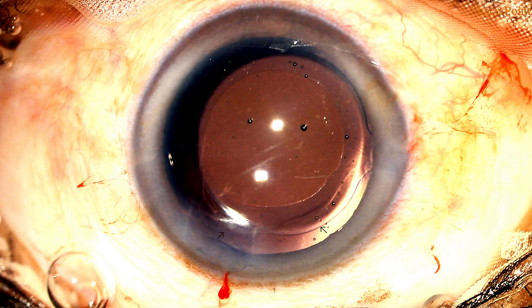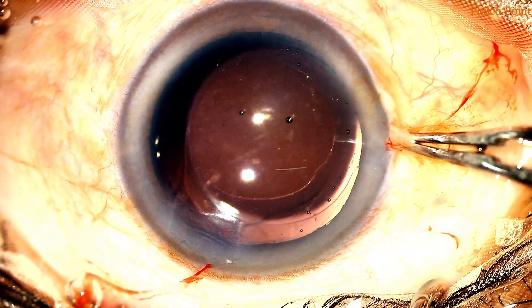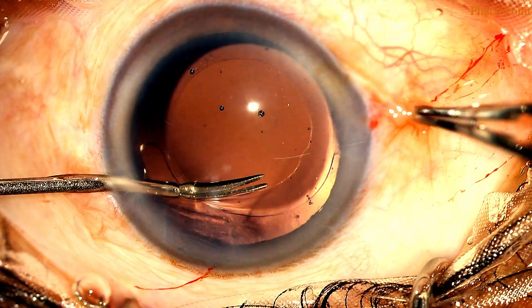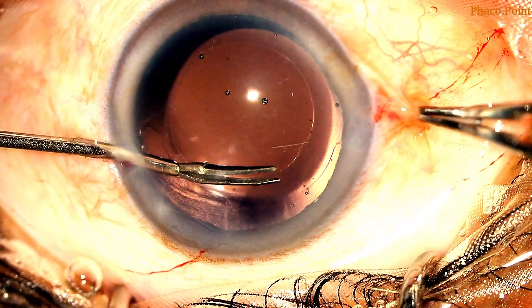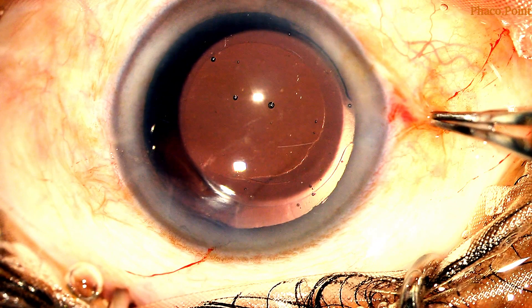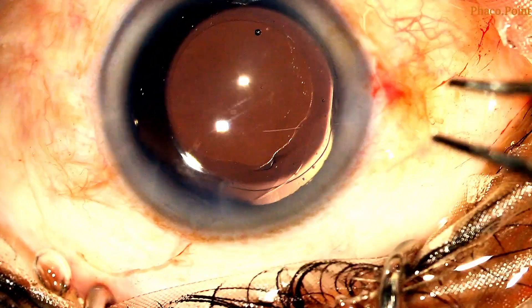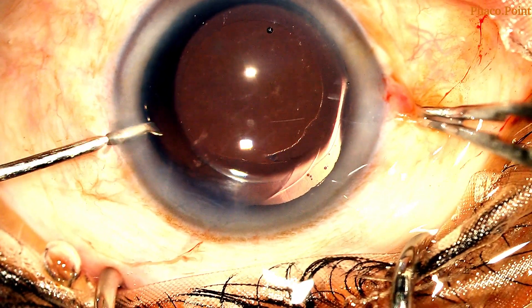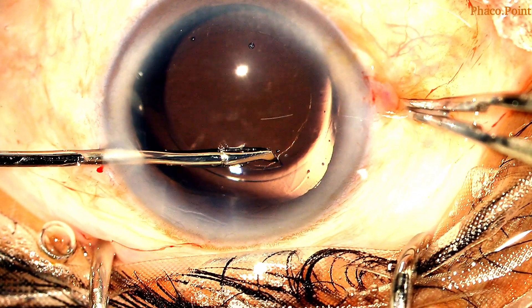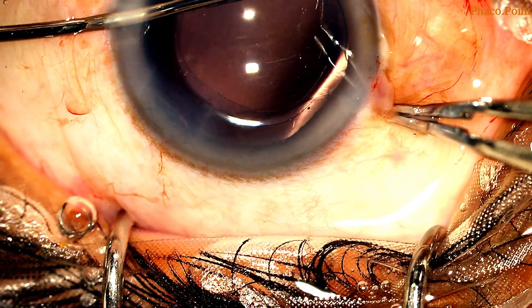Here's another case where you've got a slightly smaller RHEXIS superiorly. Adequate viscoelastic is first introduced into the anterior chamber and after fixating the globe, an intraocular scissors is introduced into the anterior chamber and creates a tangential cut with absolute ease in the anterior capsule. Having achieved this, some more viscoelastic may be introduced. With high magnification and a perfect focus on the anterior capsule, this torn edge is held with the help of an intraocular forceps, and with care, caution, and absolute control, the tear is enlarged to give a perfectly enlarged RHEXIS.